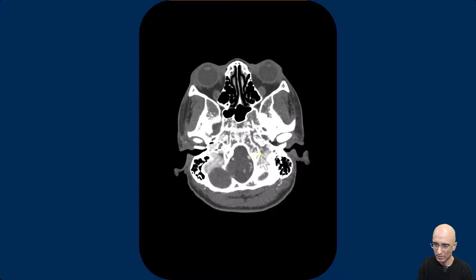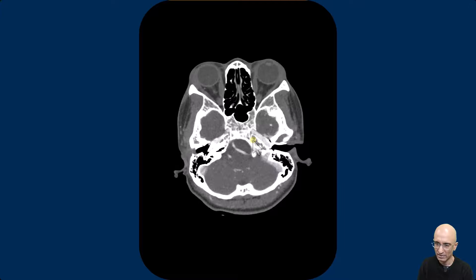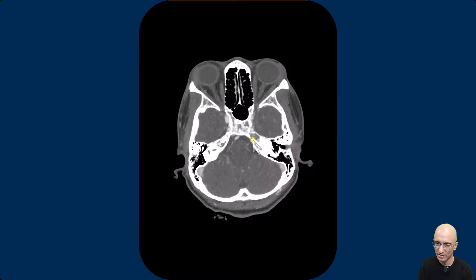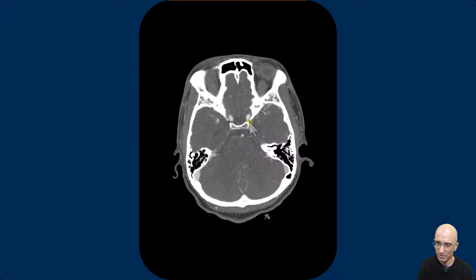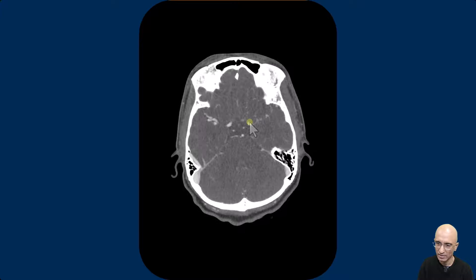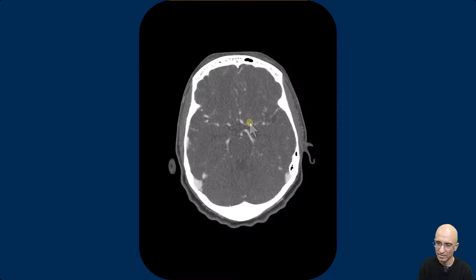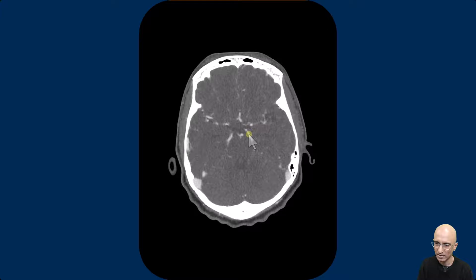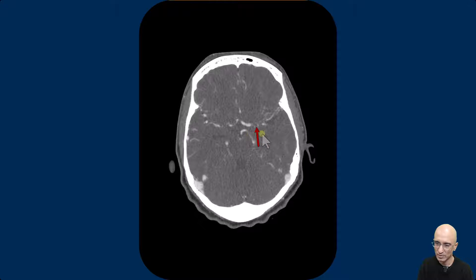As I'm scrolling from inferior to superior direction: cervical ICA becoming the petrous segment of the ICA, the cavernous segment of the ICA, the posterior communicating artery, supraclinoid segment ICA summit, A1 segment of the anterior cerebral artery — re-identified is marked stenosis of the M1 segment of the middle cerebral artery.